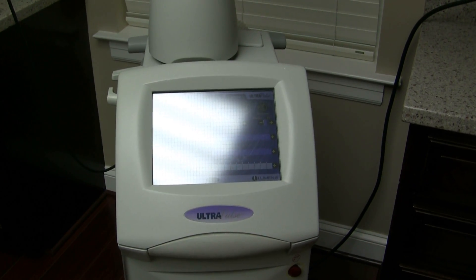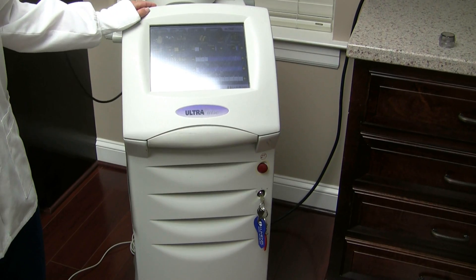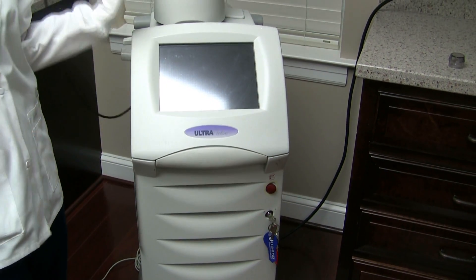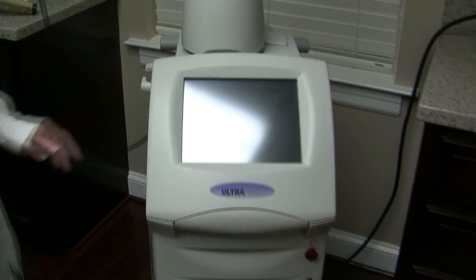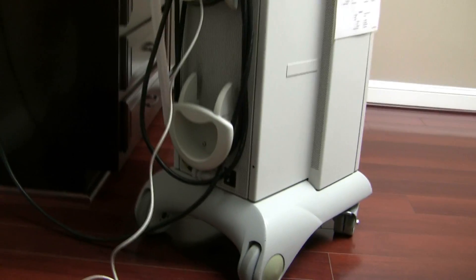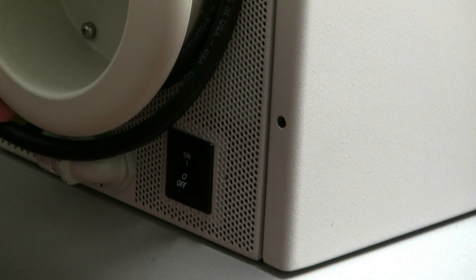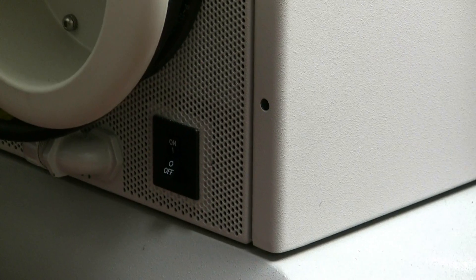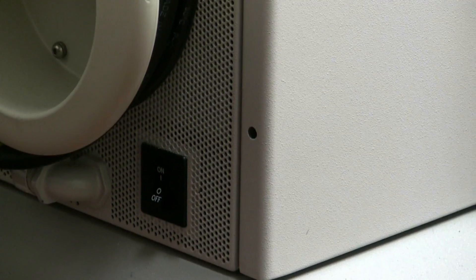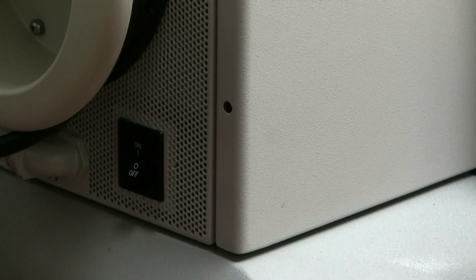That is how to use the CO2 Lumenis laser machine. When all done, turn the key in the front to the left to power off. If there is an issue with it not turning on, check the back of the machine at the very bottom — there is an on/off switch that may have accidentally been flipped to off after plugging in. My name is Jenny Jernigan and my assistant is Alyssa Coward — we appreciate you watching, and please let us know if there are any questions.